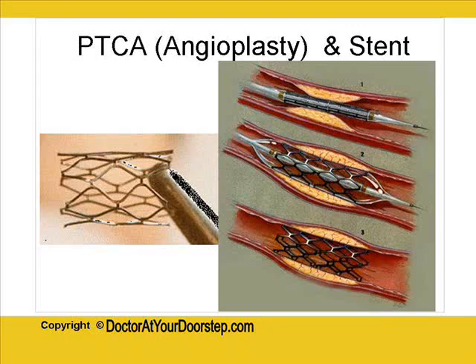It keeps the blocked part of the artery open for a longer period, which otherwise would have had a tendency to get re-stenosed. So basically a stent, or even a medicated stent which releases certain medicines, remains there and prolongs the life of the angioplasty.